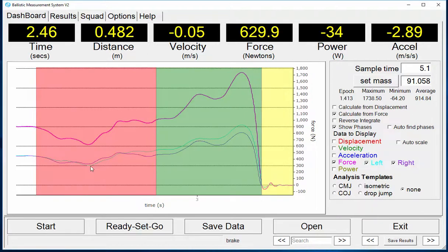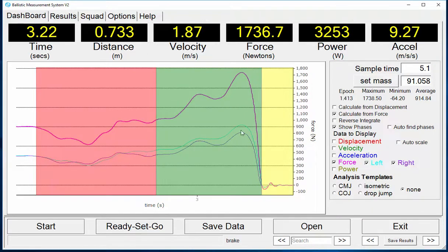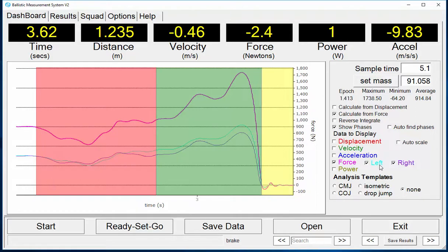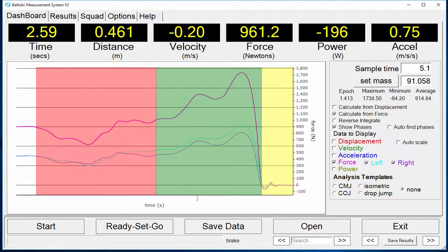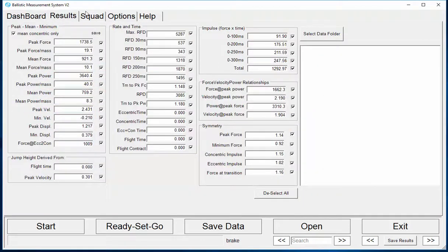Here we see the differences in the left to right for an athlete with an ACL injury of the right leg. Not only are the peak forces different, but also the area under the curve, or the impulse.